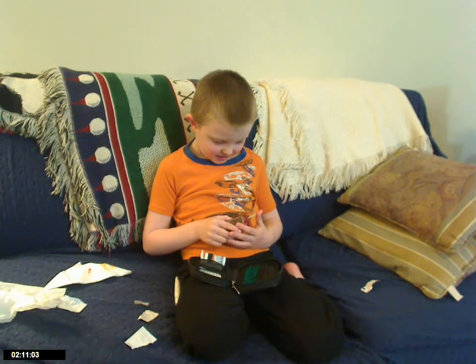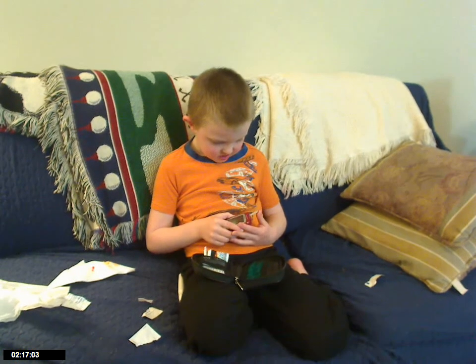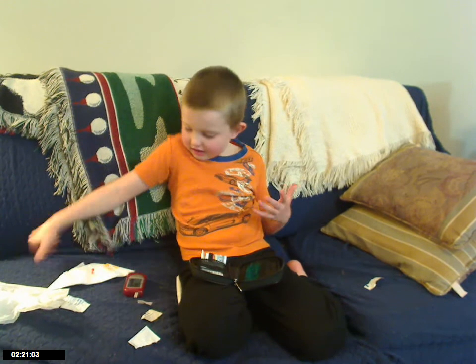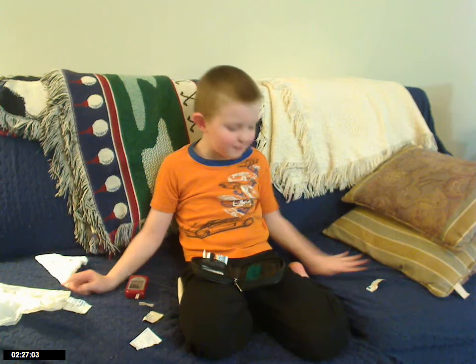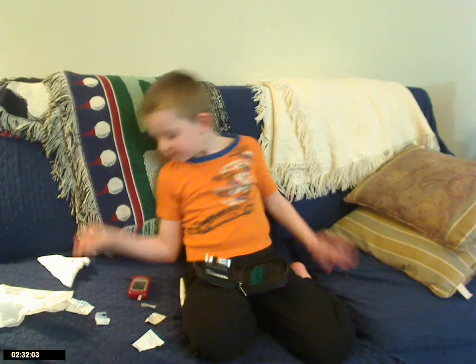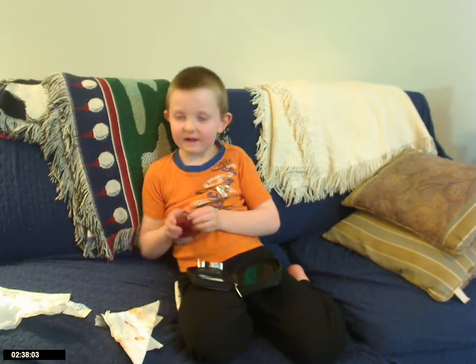Thank you for showing me how to do that. And you have to do that every day? When I eat, yes. So you only have to do it once a day, or you have to do it lots of times every day? Every time I eat. Every time you eat? Even when I go to bed. And then we even have to check it a couple other times too, like when you want a snack, or while you're sleeping.